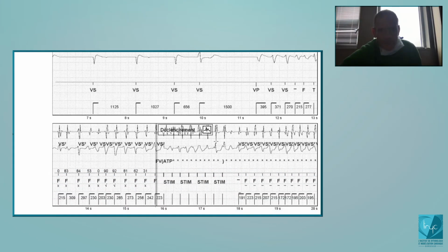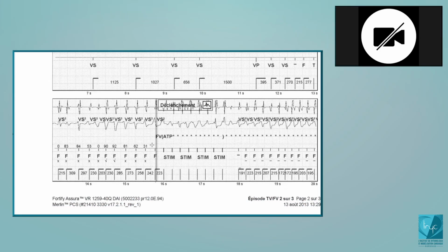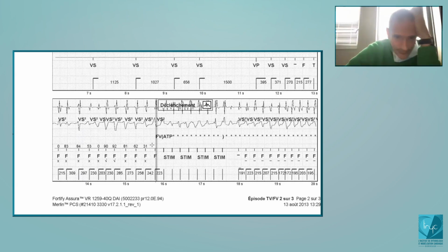But what is this now? What you see here, the marker VS2? The VS2 is the SecureSense algorithm. Yes, and you will use the same channel. I've shown you that in the guidelines, you should program SecureSense on systematically, and I really believe that's a good idea.